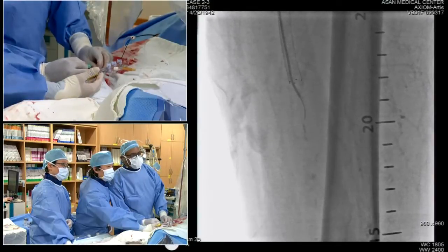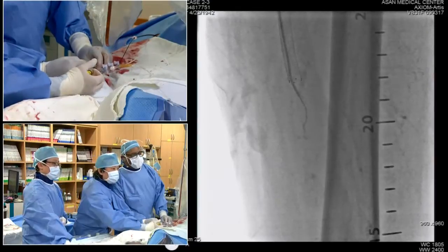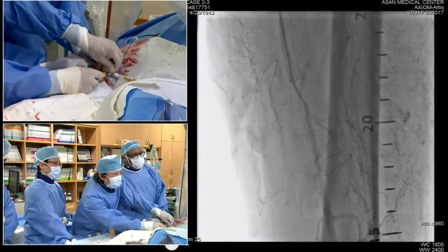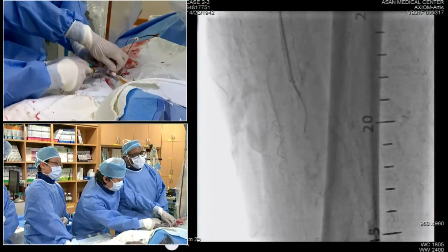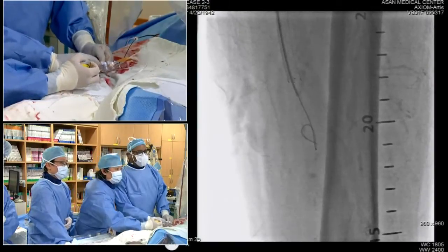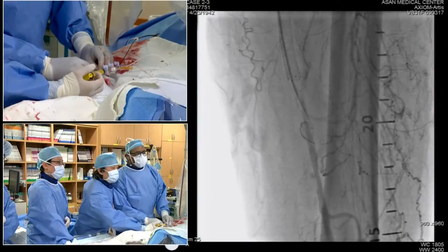Do you have re-entry devices in Korea? Re-entry has become very important. Which device? Outback? Yeah. This patient has a very tortuous iliac artery. So what are our options? What would you like to do? Yeah, the iliac bifurcation. It looks like a pretty good vessel to re-enter, though. I think it would probably be successful, but you might have to cross. We can keep on dilating here, but we're going to get proximal vessel subintimal first. This is all subintimal.